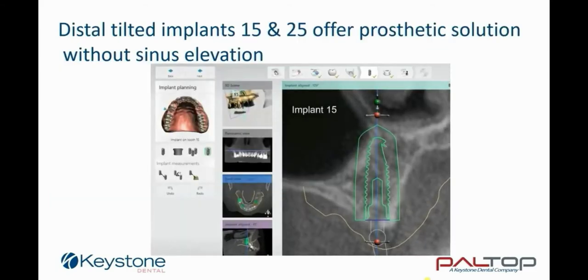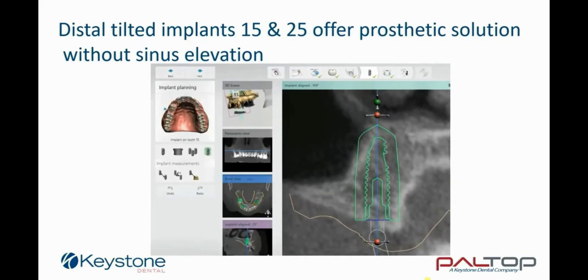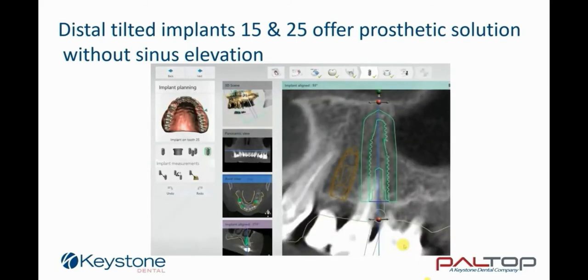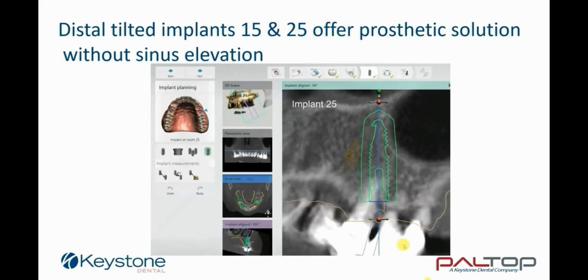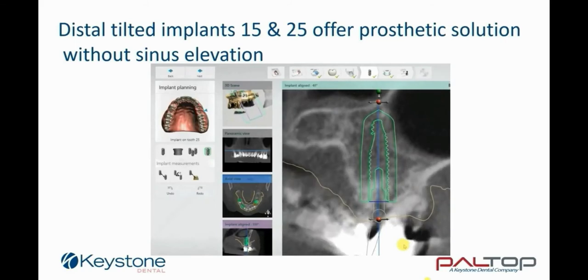Using 3D software, it is possible to lock the implant view onto the long axis of the implant and to revolve around the axis 360 degrees. This advanced feature of the software offers a unique view of the surrounding anatomy.